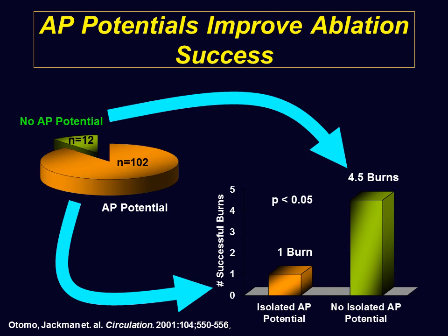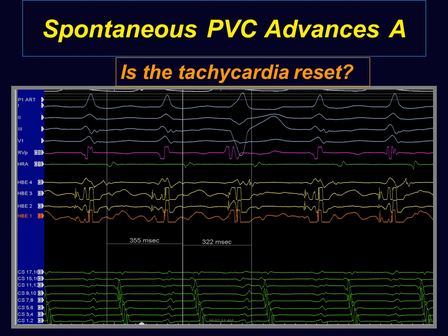And it's always satisfying to see one ablation, less than 10 seconds, disappearance of the pathway. And the recurrence rates are a lot lower if that happens compared to the pathway not disappearing. That would suggest that because it fell on the His, there's definitely the presence of a pathway. But if the subsequent AH lengthens, then it becomes very challenging to say whether, meaning the His to His never changes, then you can't say that the pathway is driving the tachycardia.